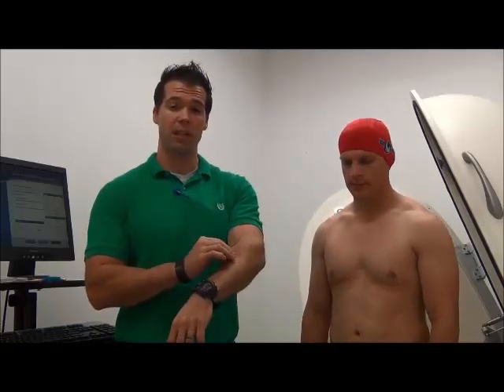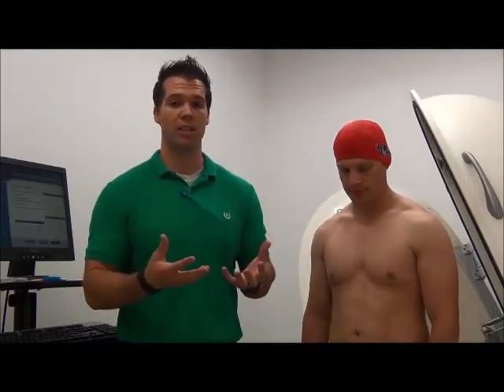Skinfold calipers, for example, predict someone's density — they pinch subcutaneous body fat, predict body density, and then put it into an equation. The bod pod is superior to that because instead of predicting density, we're actually measuring density. We have Curtis with us today as our subject.